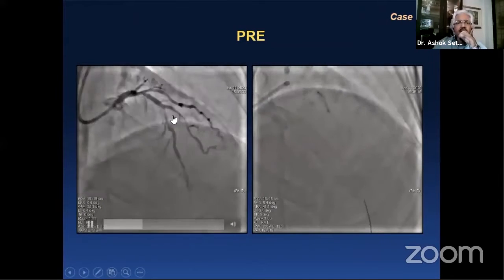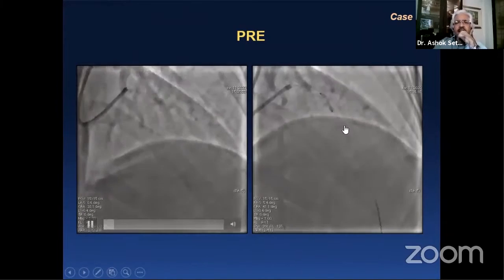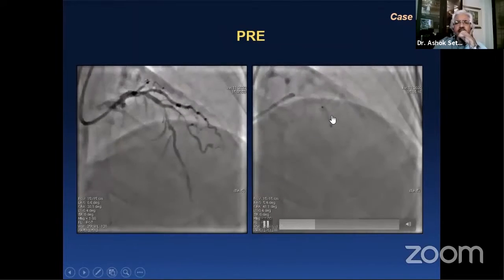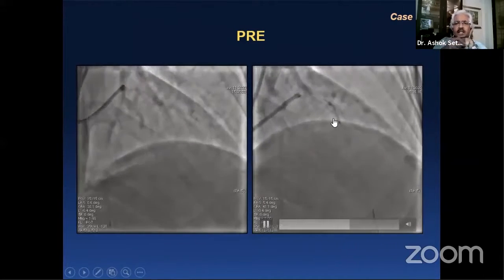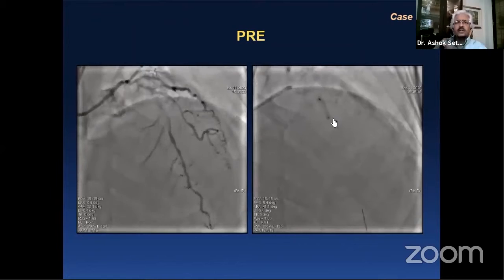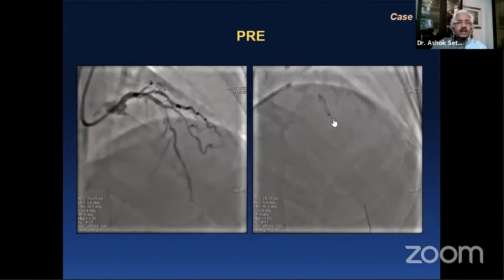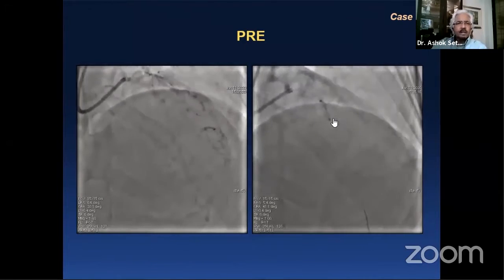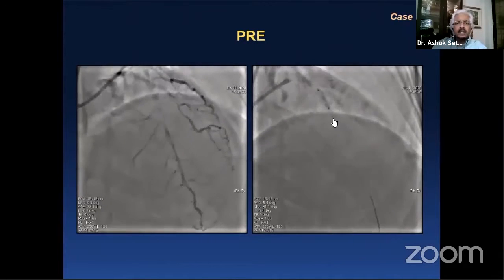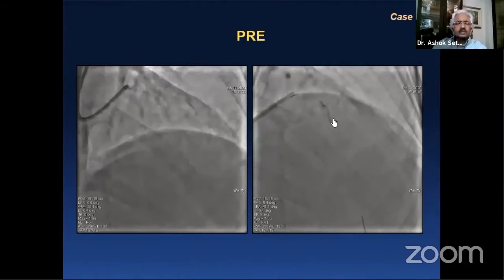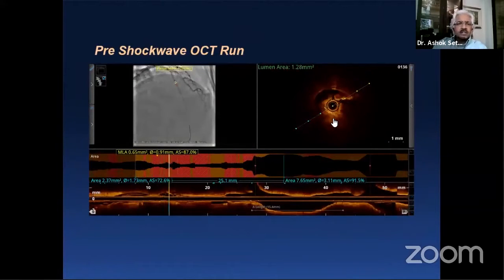This patient had a heavily calcified, concentric calcification in the LAD. You can see that the balloon actually ruptured without dilating the lesion — a classic situation for use of intravascular lithotripsy: an inability to open up a concentric calcified lesion by non-compliant balloon, which ruptured in this case.